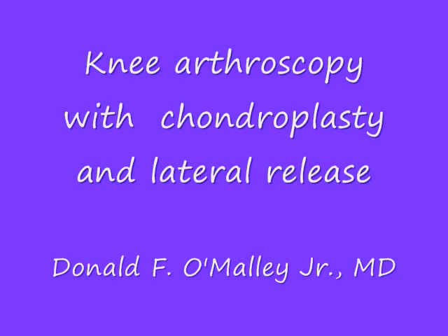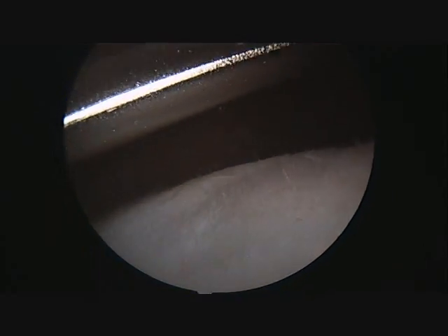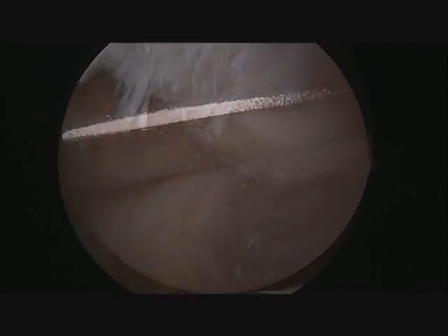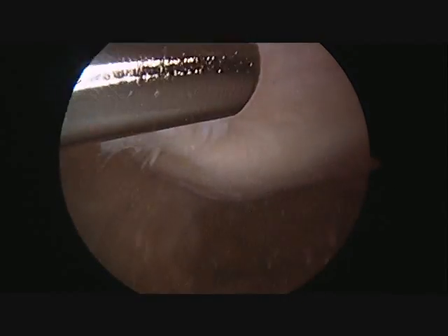Welcome to this educational video on knee arthroscopy with lateral release and chondroplasty. We can clearly see that there is some chondrosis, which is roughening of the cartilage of the patella or kneecap, as well as the femur or thigh bone.